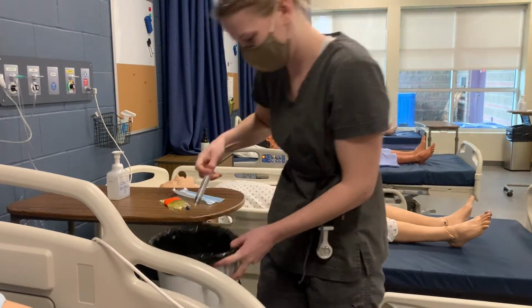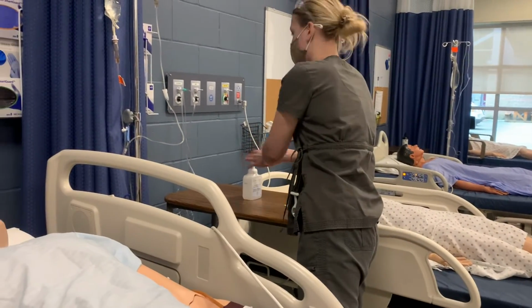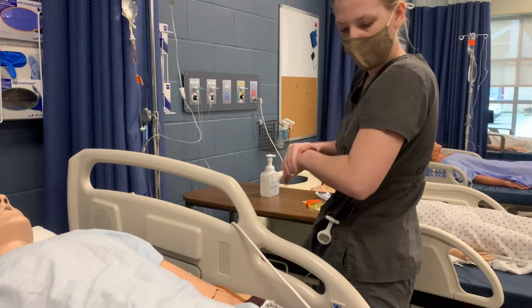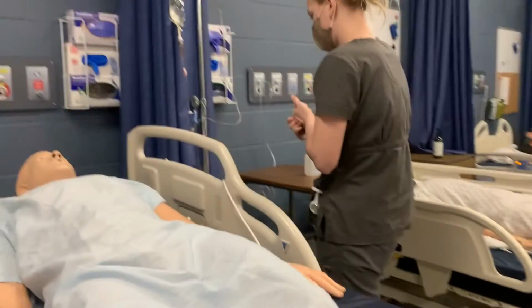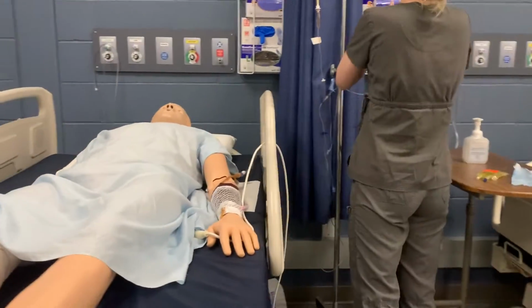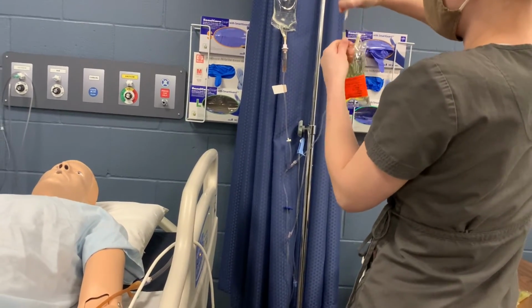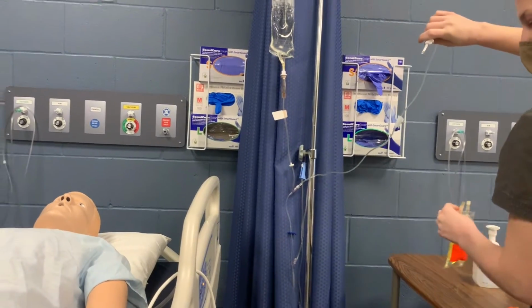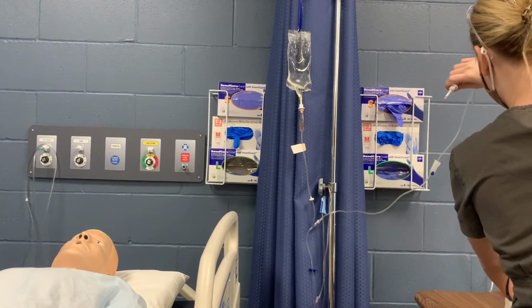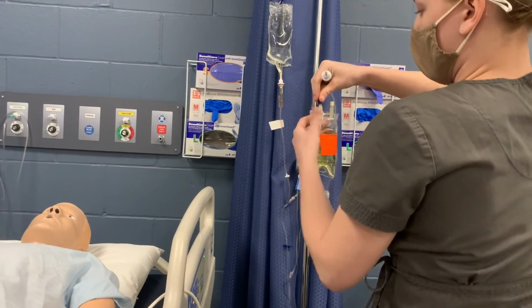Just like that. Okay, so now that that's done, I'm going to be needing my IV medication. And my port is flushed and it is cleaned. So I'm gonna take this bag off here, flip it upside down so I don't get it all over me, take out that spike. That was really good. I'm gonna lean it up against something. There we are. And then I can go ahead and grab this.